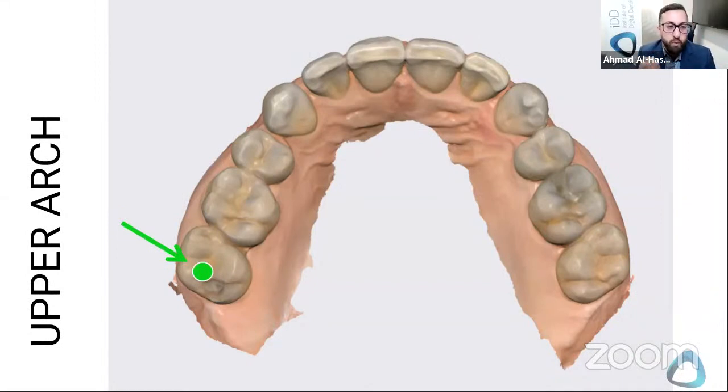So Khalid, when you said premolars, maybe if you're taking half an arch, but really you want to start on the occlusal of the most terminal tooth. Perfect. Veronica and Joanna, you guys are onto it. It's the most identifiable reference point.